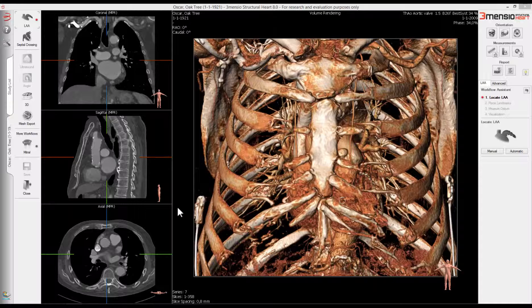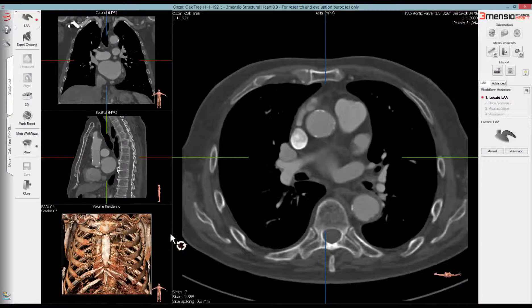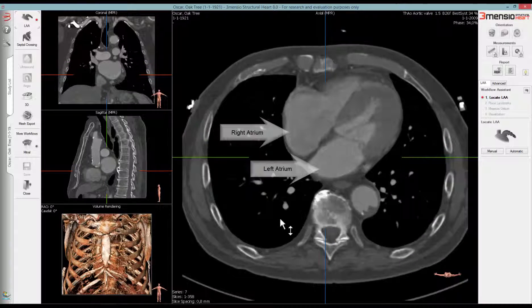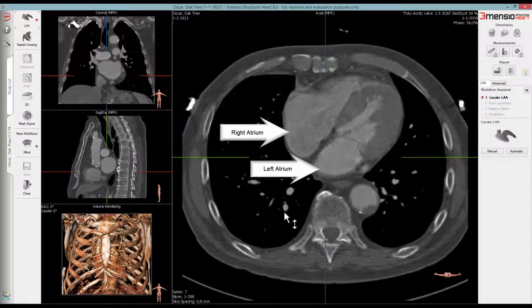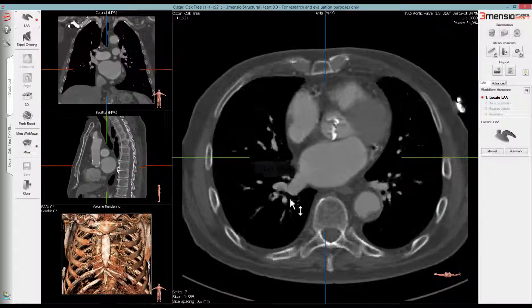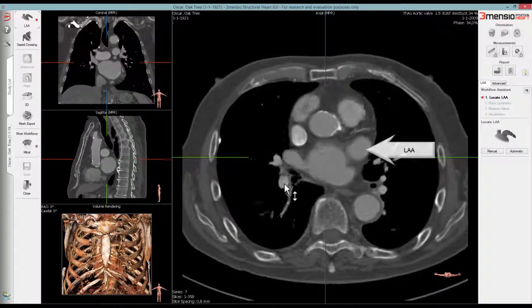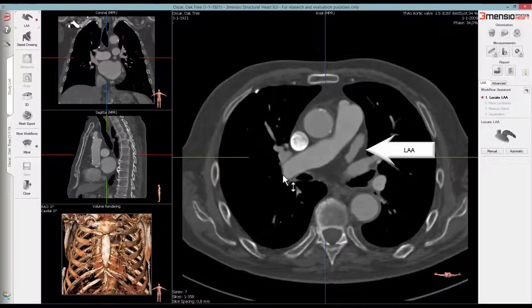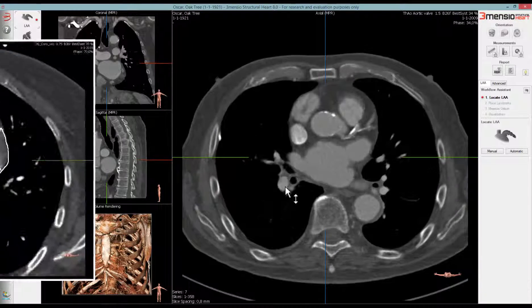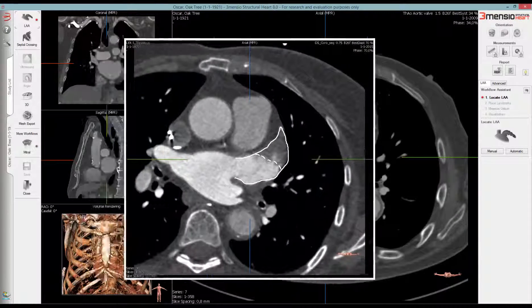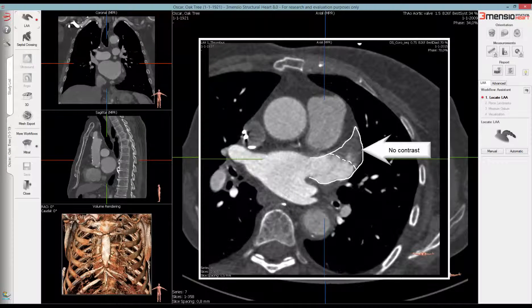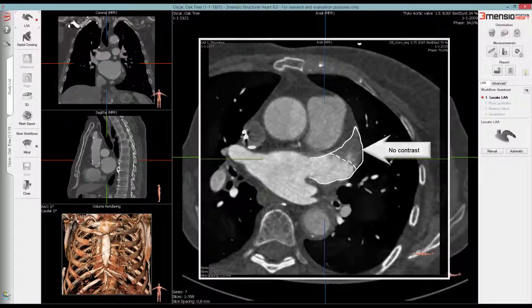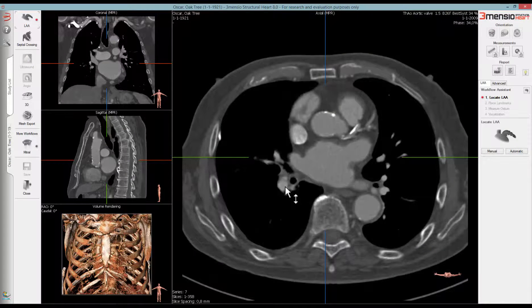We will start by assessing if the LAA contains any thrombus. Double-click on the axial view to enlarge it, then scroll through the slices to look for the four-chamber view. From here, look for the LAA on the left atrium. If the LAA is not completely filled, this can be due to thrombus or a filling defect. If a late enhanced scan is available, this can be used to rule out thrombus.